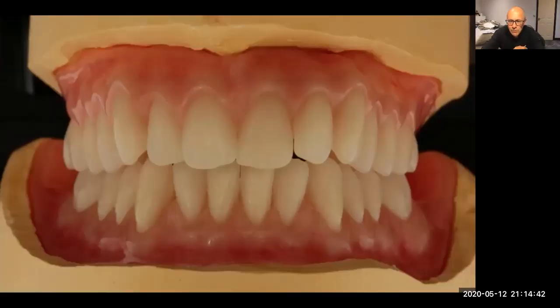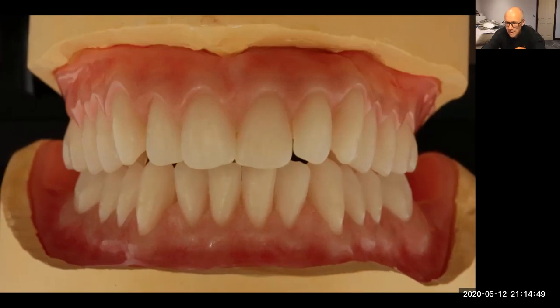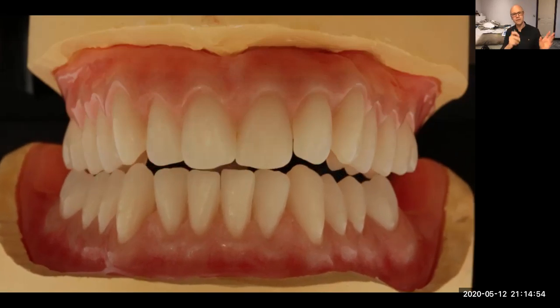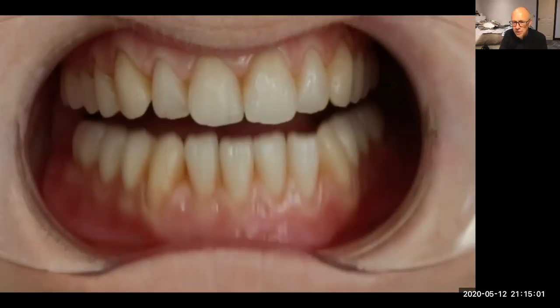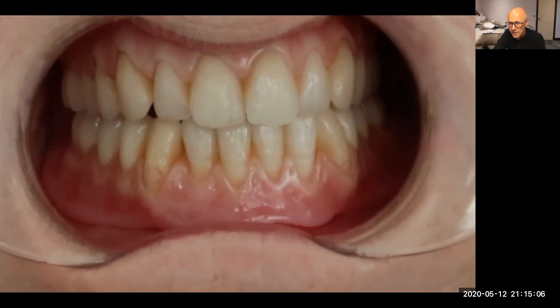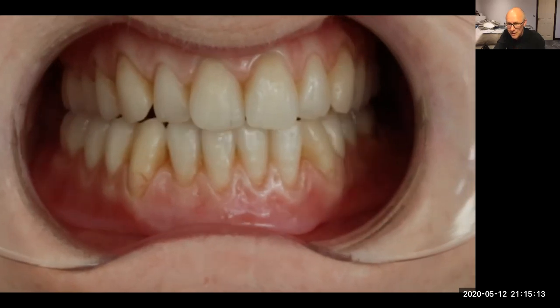What Rowan always does is set the teeth up like this. This is called balanced articulation. So there are balancing contacts on the non-working side for the dentures, just to increase the stability of the dentures. But getting balanced articulation physically in the mouth is very, very difficult to do, and I don't think you need to worry too much about it. Getting that sort of balance is really difficult.